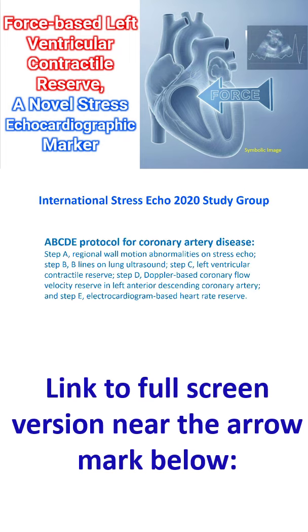International Stress Echo 2020 study evaluated the prognostic value of left ventricular contractile reserve both in ischemic and non-ischemic heart disease. The study used ABCDE protocol for coronary artery disease. Step A, regional wall motion abnormalities on stress echo. Step B, B lines on lung ultrasound.